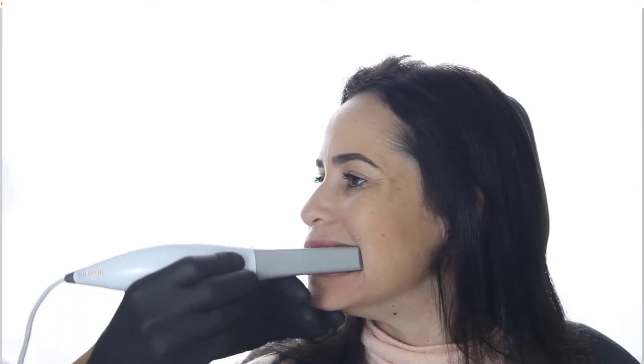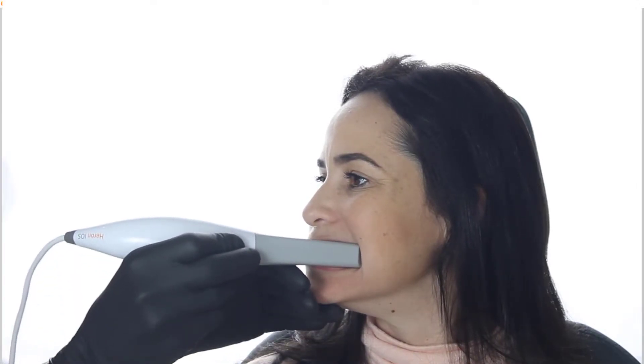Before the patient locks the bite, place the scanner into the back of the mouth and lightly retract the cheek with the tip. The patient can now bite and we can start scanning. A good starting point is the first molar.